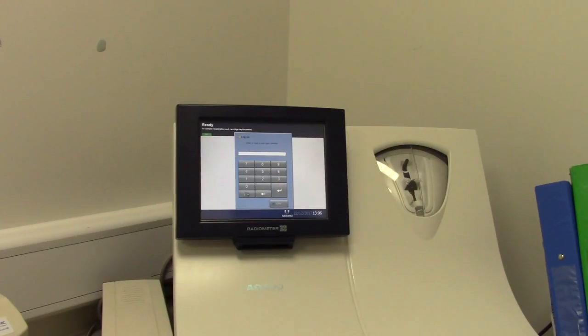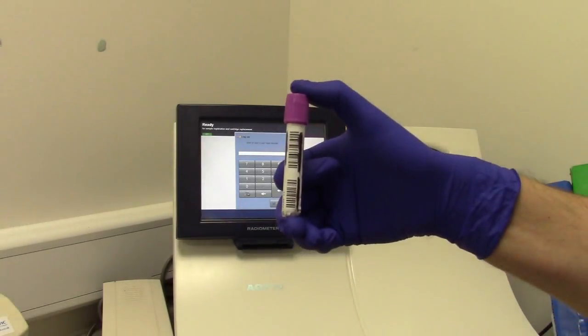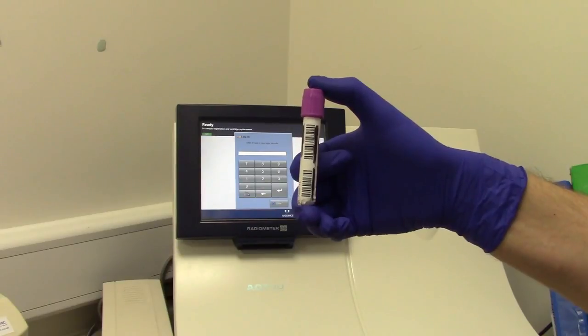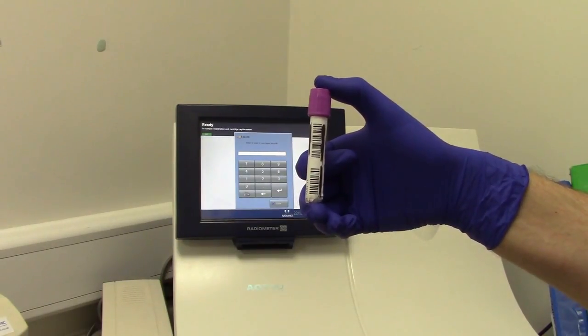You need to have 2 mLs of blood in a small purple top Vacutainer and have the patient's barcode ID attached to the tube.